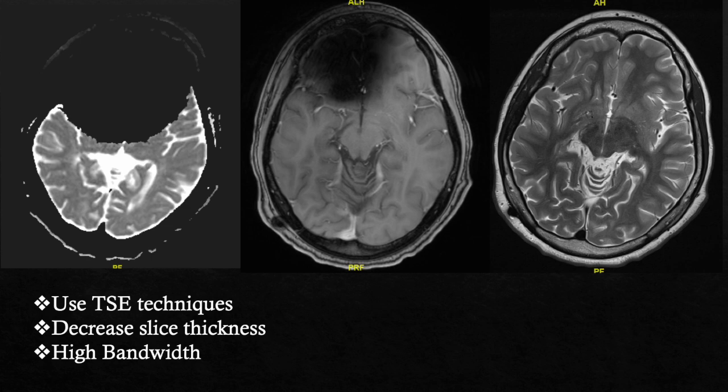The best sequences to get around these artifacts are a combination of spin echo and a short TE, and these are usually found in fast spin echo techniques. So this T2 is a good example of that. So another way you can minimize is decreasing the slice thickness. That can also help.